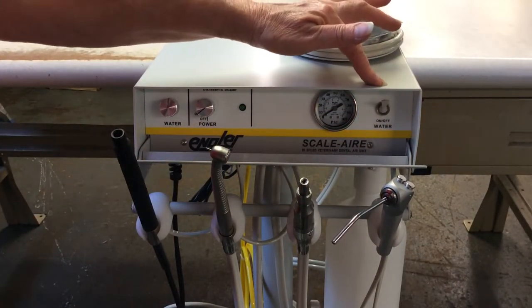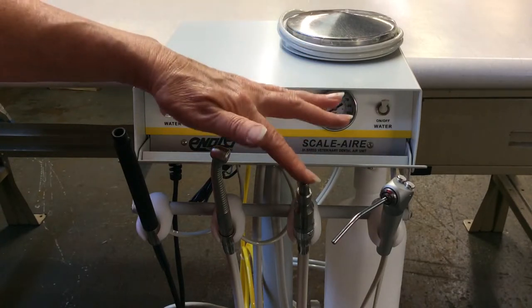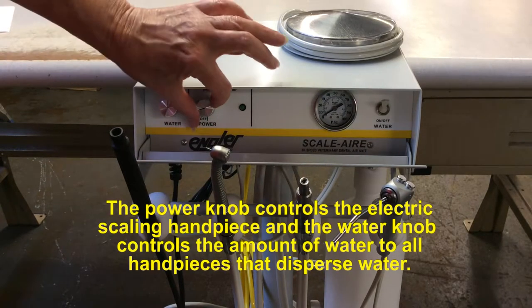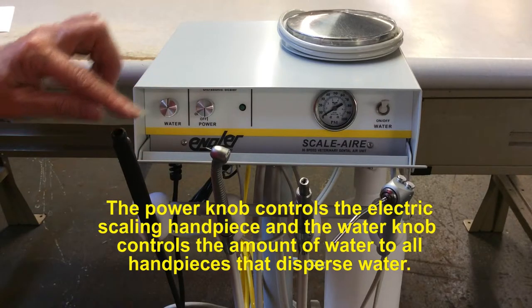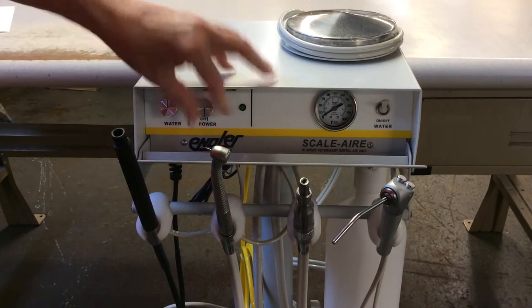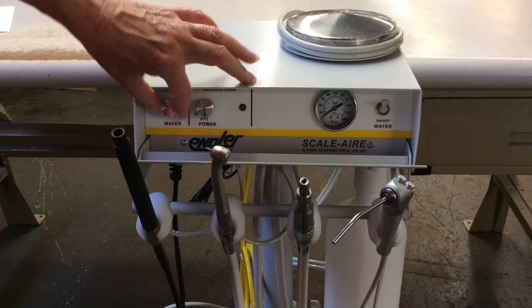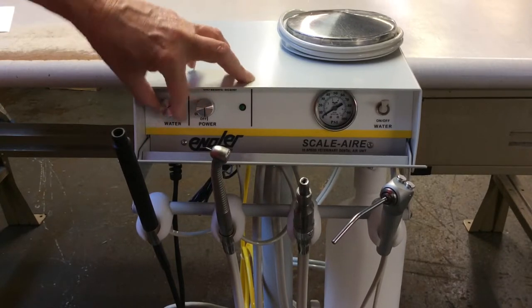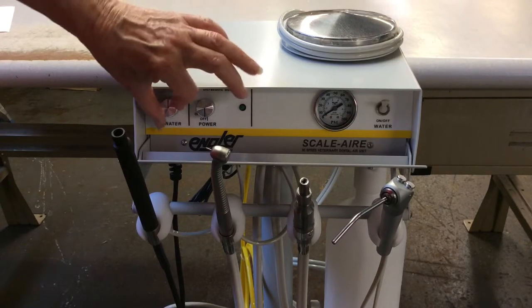The water switch can be left on all the time. The foot switch controls the scaling hand piece, the high speed, and the low speed hand piece. The power knob controls only the scaling hand piece, and you can go from low to high. The water knob controls the scaling hand piece and the high speed hand piece. Turning it all the way clockwise gives very little to no water; turning it back the other way gives a lot of water, so choose the water level you wish somewhere in the middle.